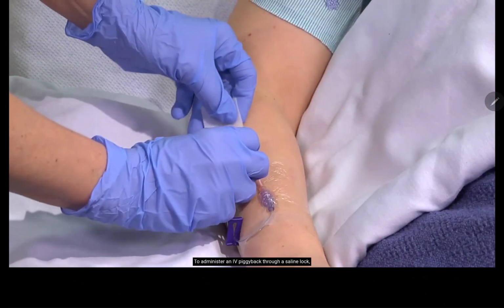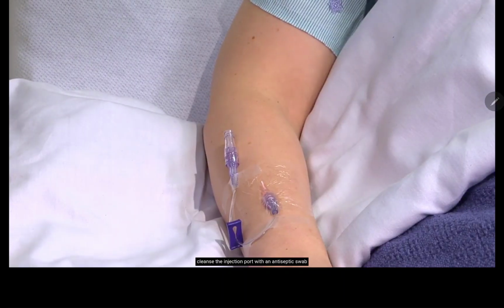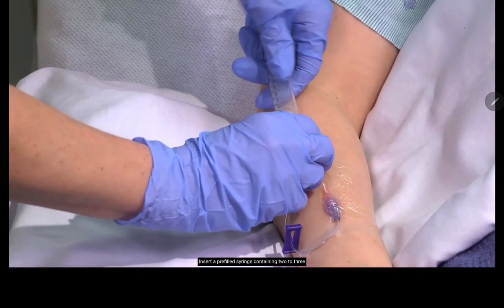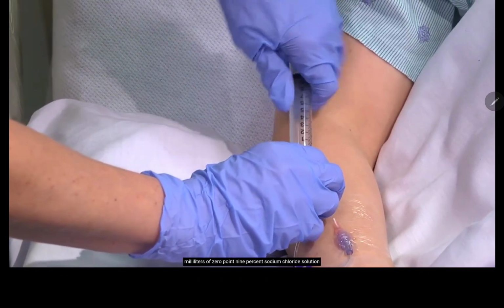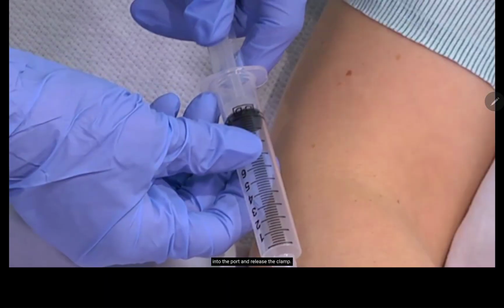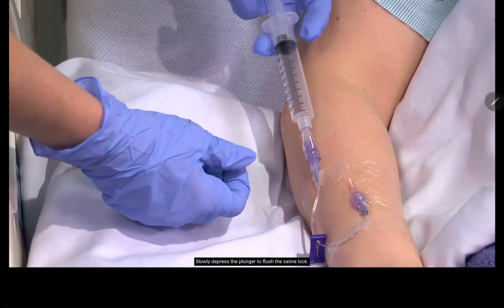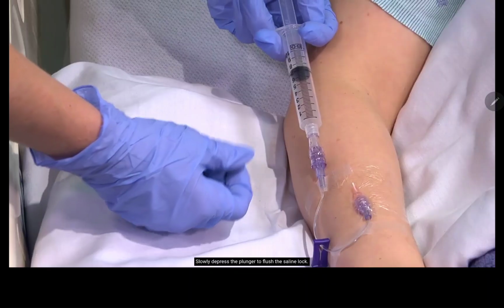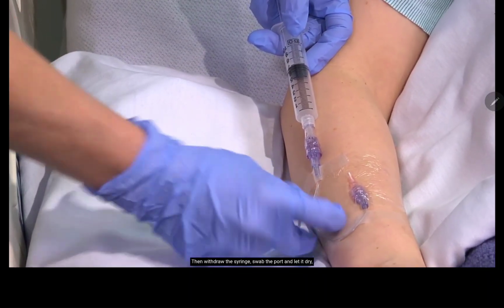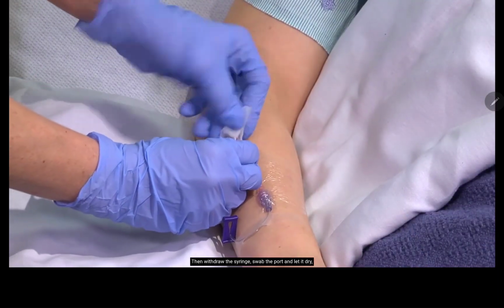To administer an IV piggyback through a saline lock, cleanse the injection port with an antiseptic swab and let it dry. Insert a pre-filled syringe containing 2 to 3 milliliters of 0.9% sodium chloride solution into the port and release the clamp. Pull back gently on the plunger of the syringe and check for blood return. Slowly depress the plunger to flush the saline lock. As you proceed, observe the site for infiltration. Then withdraw the syringe. Swab the port and let it dry.